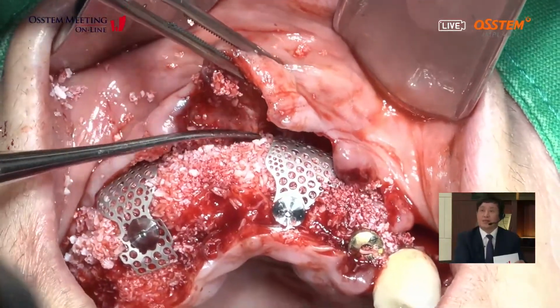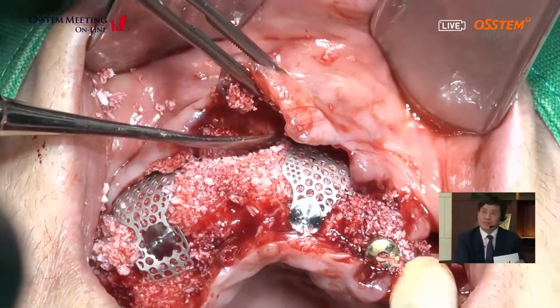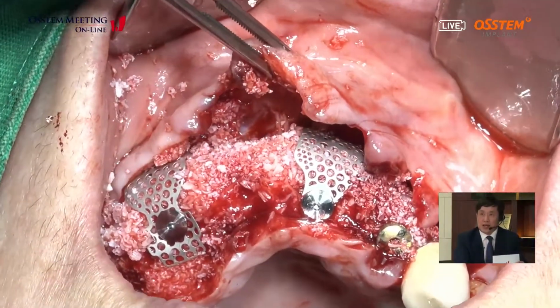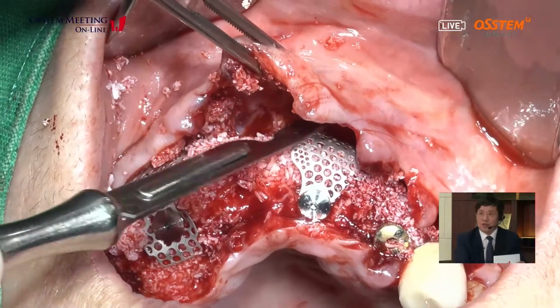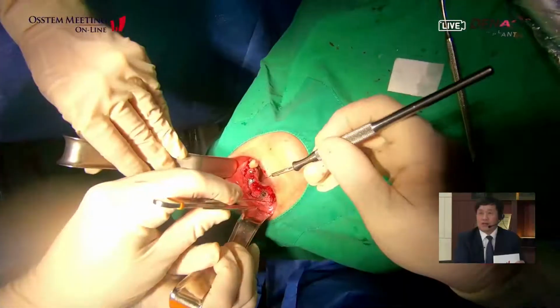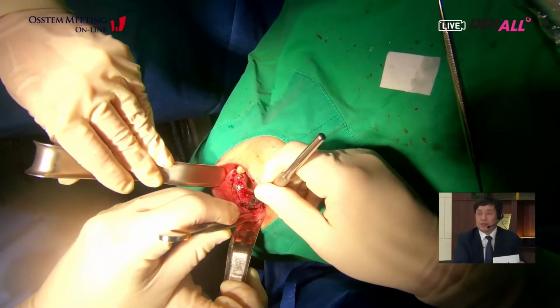When using the periosteal releasing incision, it is maybe good to make it with a new knife because of the clear cut of the periosteum.